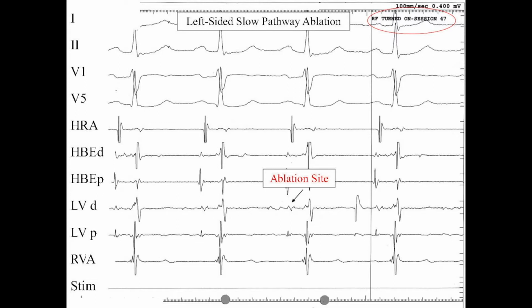So there are definitely cases, whether they failed by you before, failed by someone else before, or you've been in the lab delivering a lot of right-sided lesions, to consider going to the left side.